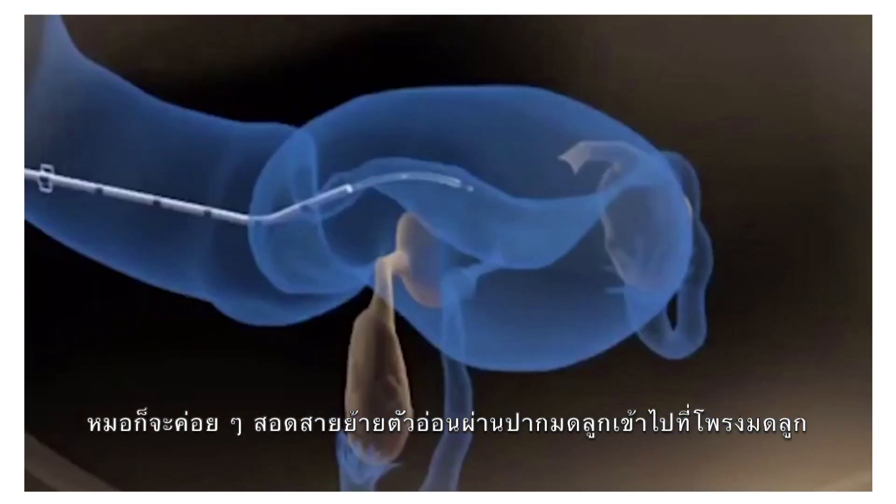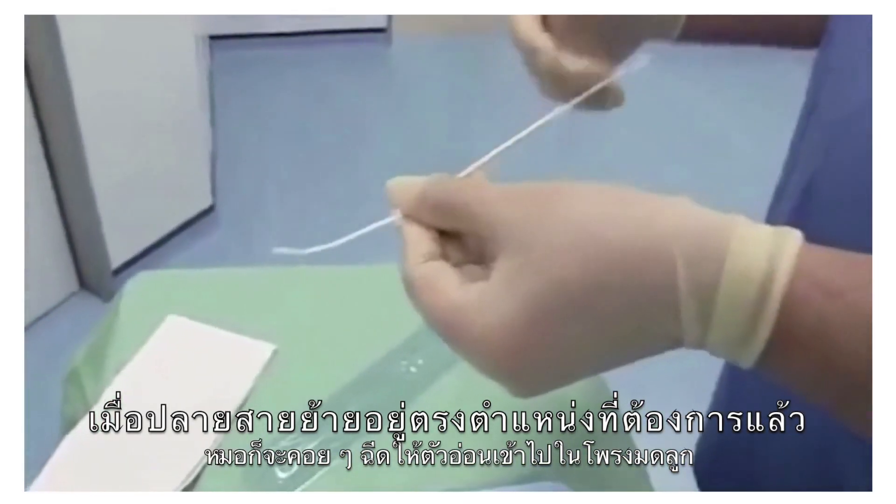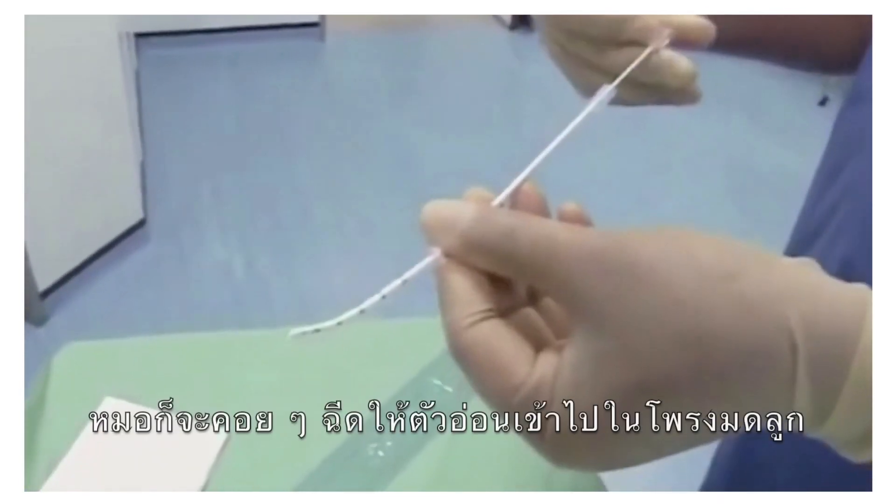The physician will then insert the catheter through the uterine cervix into the uterus. With the catheter in place, the physician will then inject the embryo into the uterus.